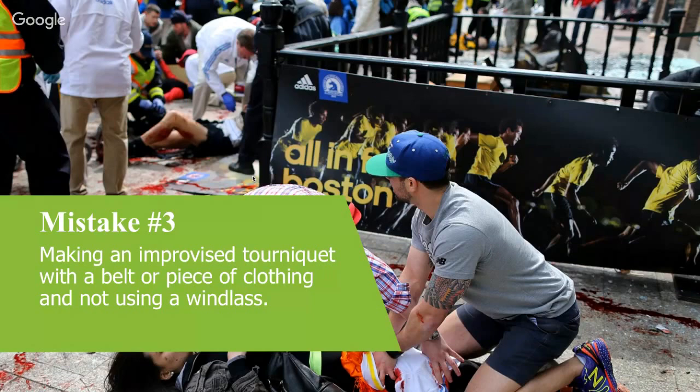Again, if you don't do it tight enough the first time and it's a venous tourniquet, then you can increase the amount of bleeding, which we'll talk about later, and you'd need to completely undo all those wraps around the limb and then reapply it. So unlike a windlass tourniquet, where you can just do another half turn or another turn on the windlass, you can't do that with a rubber tourniquet.